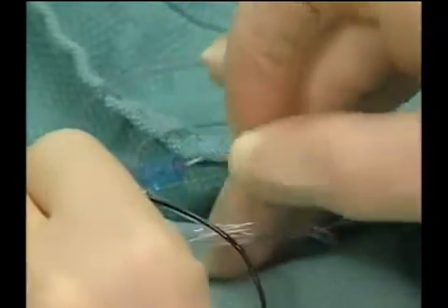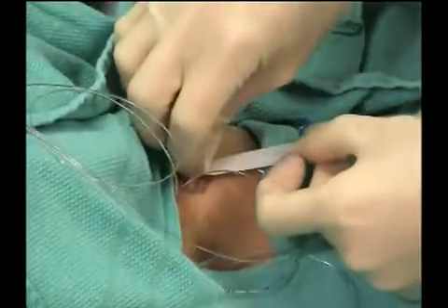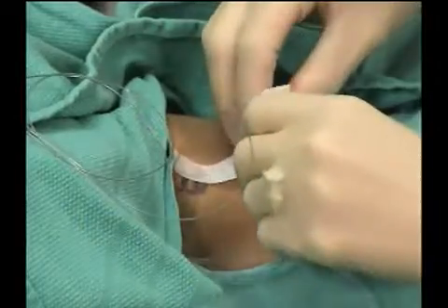We use the push and pull technique to remove the needle, and the dilation of the brachial plexus sheath confirms that the needle was in the right position, and then secure the catheter with Steri-strips.